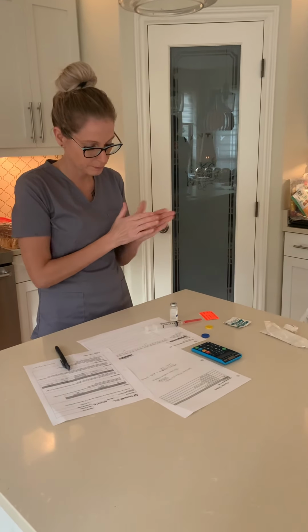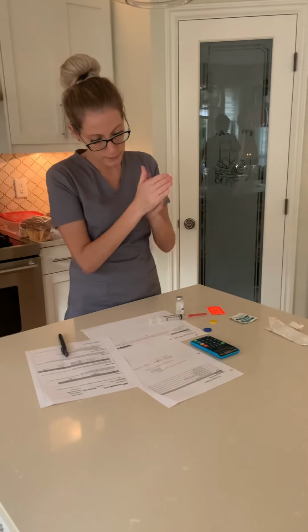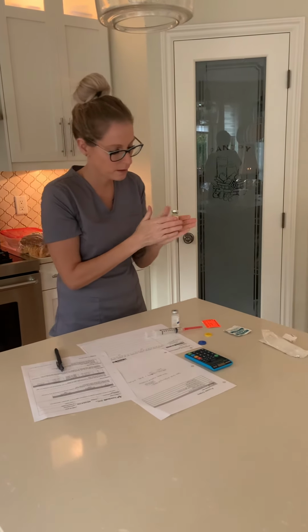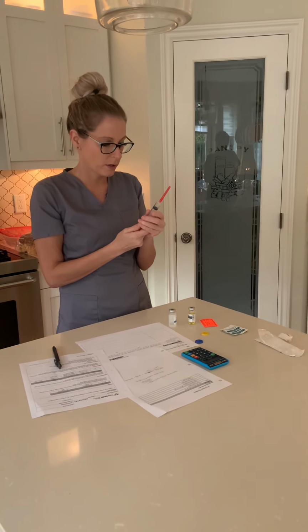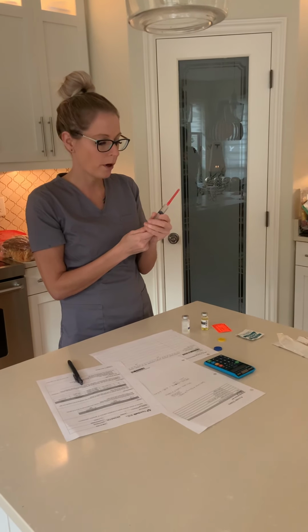And I'm just going to roll. Biggest thing with rolling is you want to make sure it's all mixing in with the water and there's no clumps to ensure that the dose is as effective as possible. So we're all mixed in there. So I know that I'm going to be withdrawing 2.4. So I'm going to draw back, let's say up to 4 just to ensure.